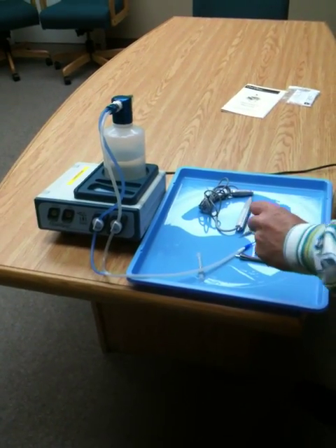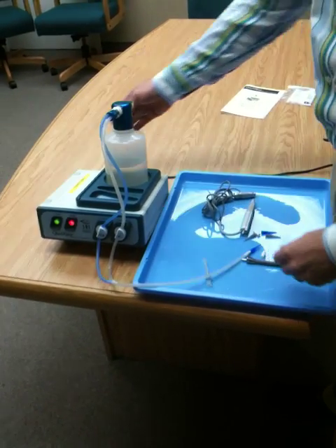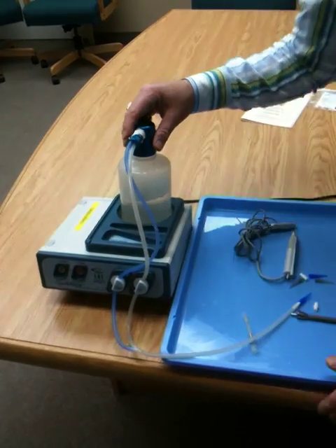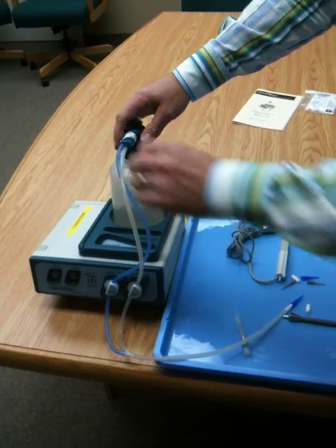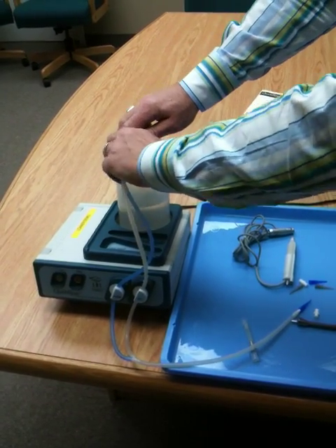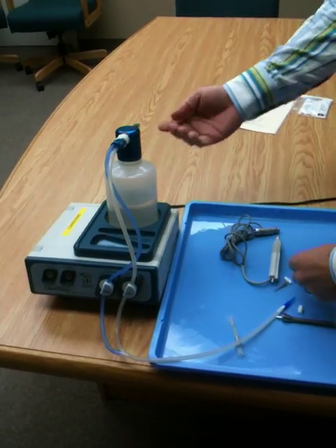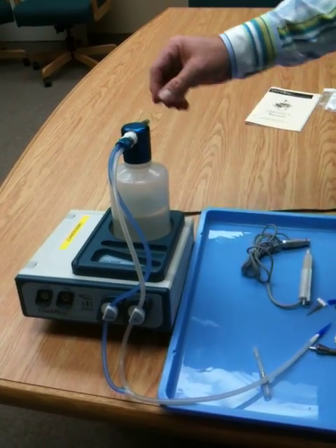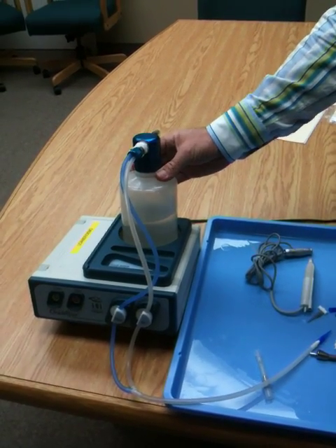One of the most common problems with the operation of the unit is air leaks. So make sure that when you're using the unit, listen for air leaks — you can hear or see water leaking. Check to make sure all your quick connects are tightly snapped in place; make sure you hear a click when you snap them in. There's a white rubber gasket inside the bottle cap — make sure that it's not missing, or else you will get air or water leaking from the bottle cap.